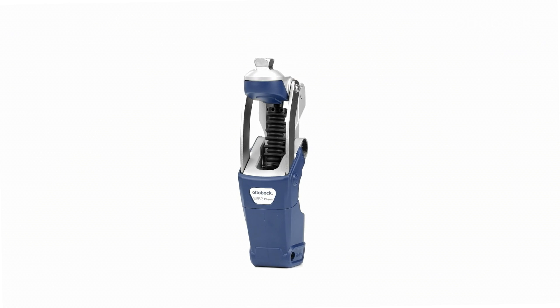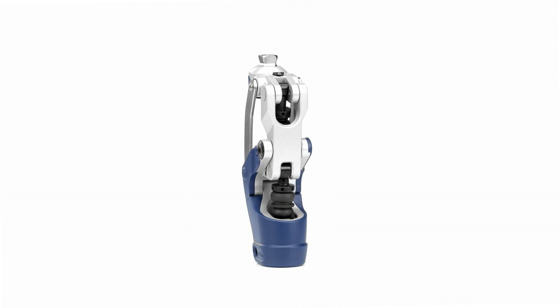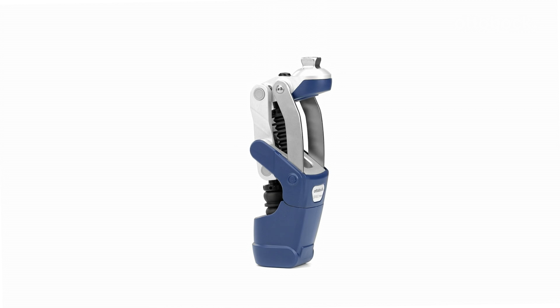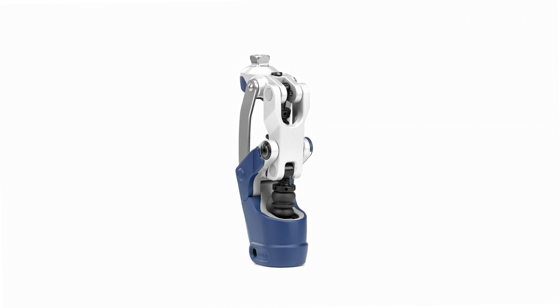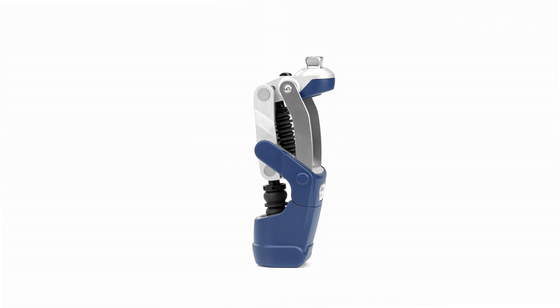The Pheon 3R62 is a polycentric knee with stance phase flexion control and an innovative mechanical swing phase mechanism. Its functions make it especially well suited for low mobility users. Thanks to the optional integrated lock, which can be activated or deactivated by the prosthetist, Pheon provides targeted support for the post-amputation therapy process.